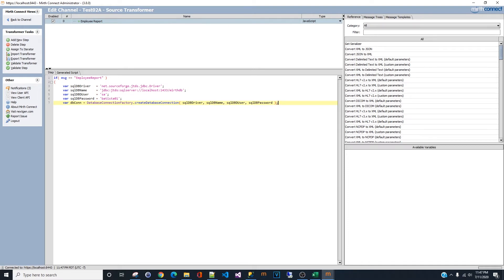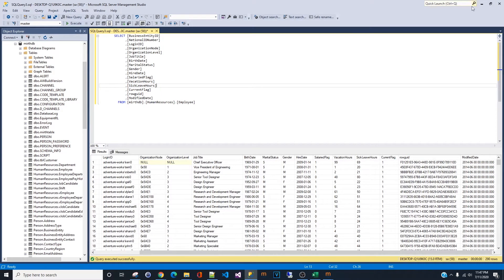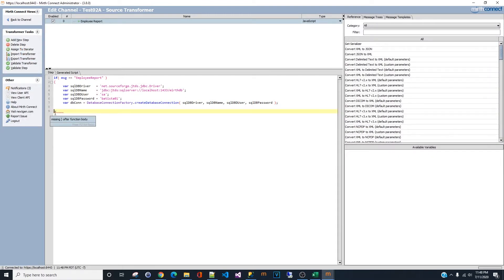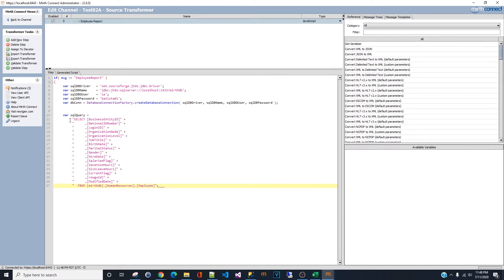The next step is to write our query. Here's the code — this is how you create a connection string using JavaScript in the transformer. You have the driver, the database name, the username (account), and the password. The SQL code must be wrapped in a string, and if the query is too long, you have to concatenate it to another string. It's a little annoying but you have no choice.